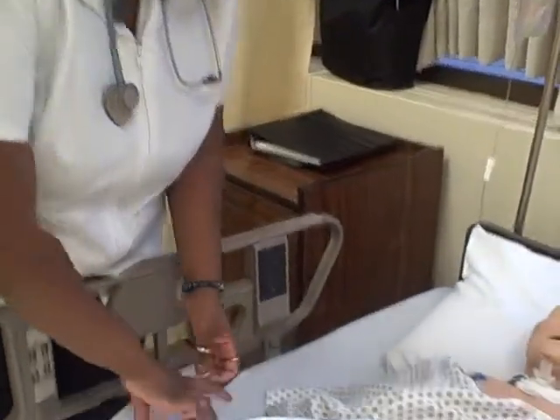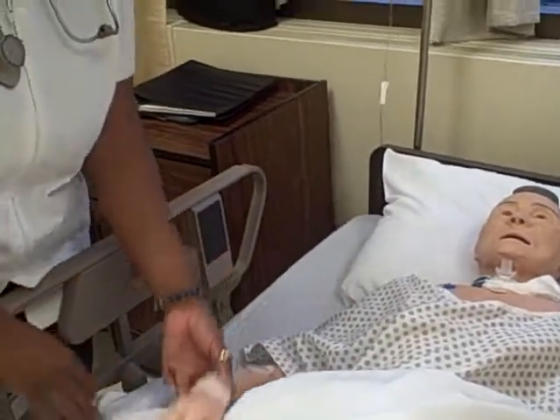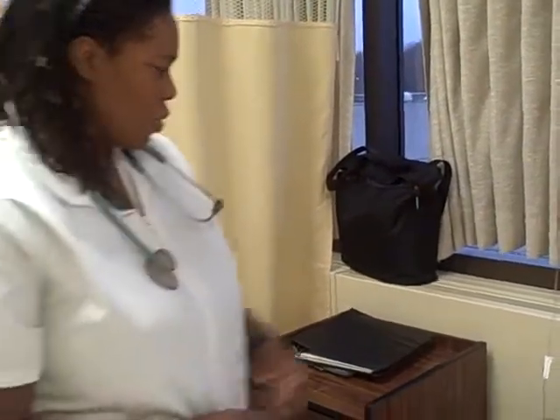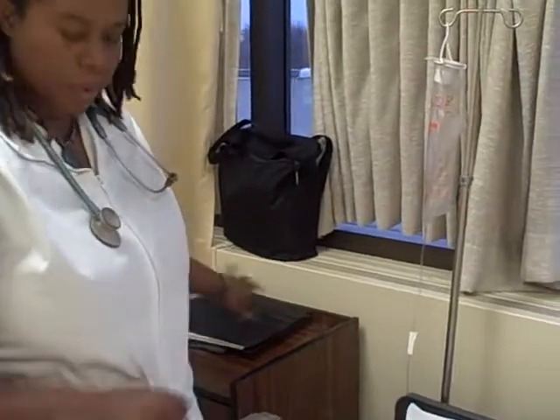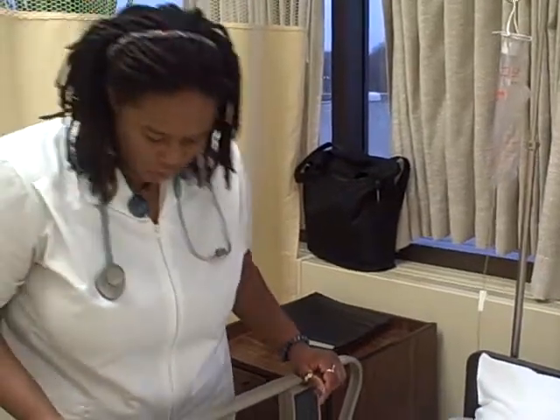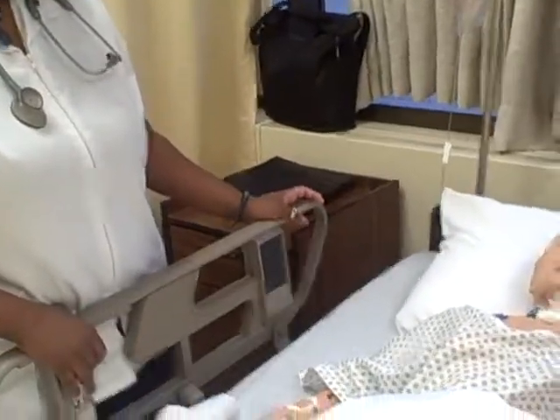I want to check the patient's ID band, making sure that it's the right patient. I want to introduce myself to the patient and explain today's procedure. I want to turn off the feeding pump, raise the bed to a comfortable working height, and raise the head of the bed approximately 45 degrees.